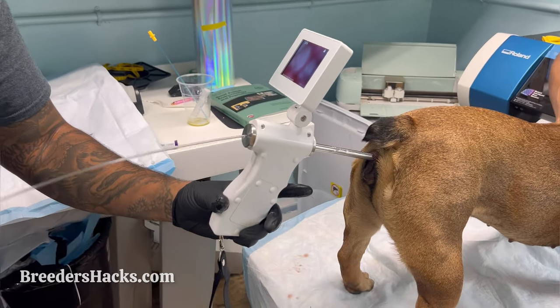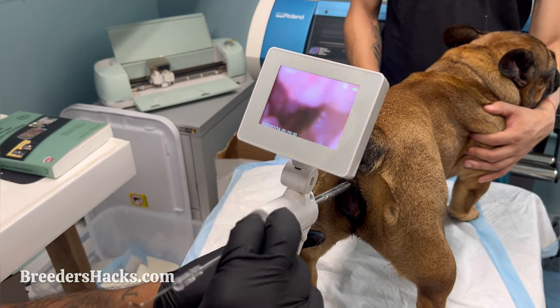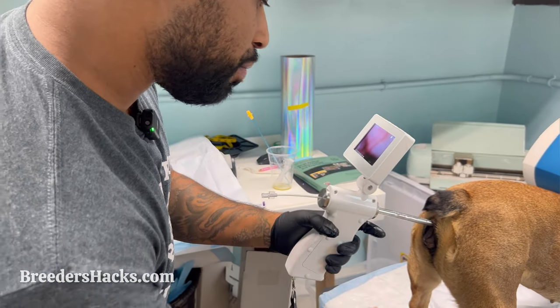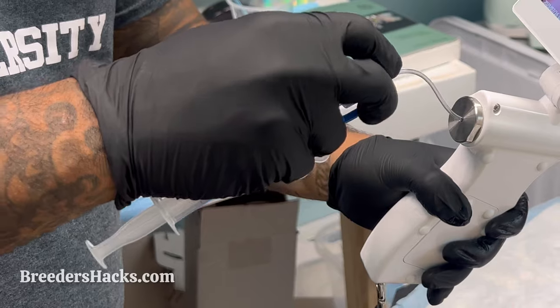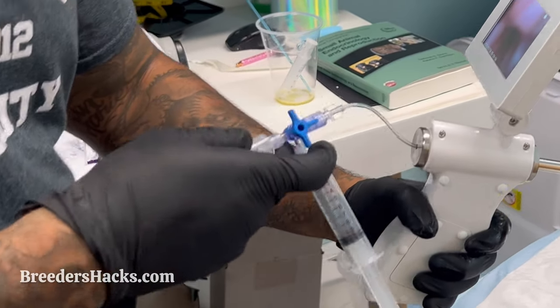We're going to stick our catheter through — give yourself a little bit of space so you can see. Right there — we're sticking it right through into the uterus. Once we're in the uterus, pull out the rod, and we're going to attach and affix our three-way AI valve. One key thing when doing this is you definitely want to make sure the dog is restrained from moving too much.